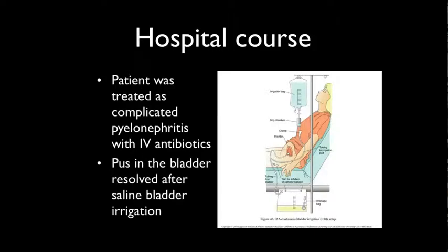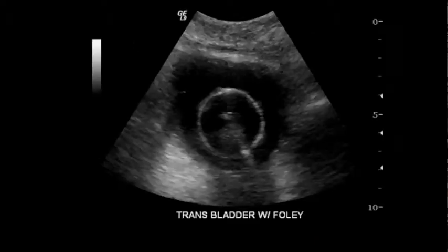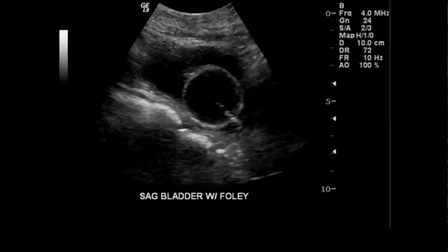The patient was admitted and treated for complicated pyelonephritis with IV antibiotics and saline irrigation of the bladder, after which the pus within the bladder resolved. This is a representative of a repeat ultrasound prior to discharge showing a Foley within the bladder and a normal bladder contour, and the wall appears normal and thin. And this is another sagittal view of the bladder.